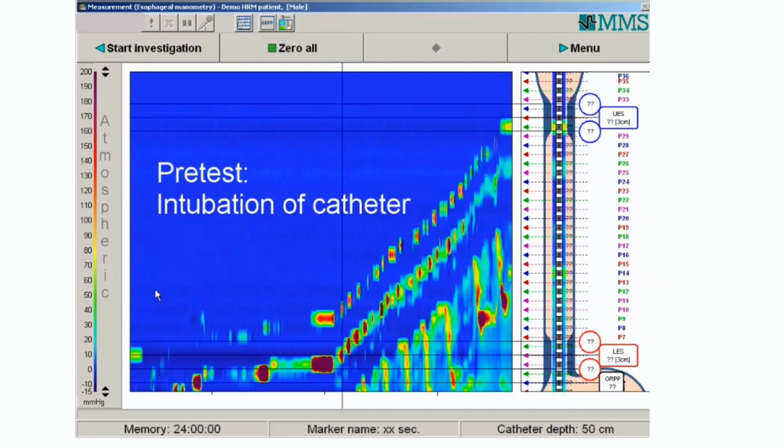Then you put the catheter exposed to the atmosphere for the calibration. What does it mean? Does it mean just hold it like this? Yes. So this is the catheters, connected to the system, and I hold from the end. I have to make sure that I am not pressing on any sensor, because there are sensors on the catheters. So I have to make sure that I am not holding or pressing the catheters on the sensor itself.